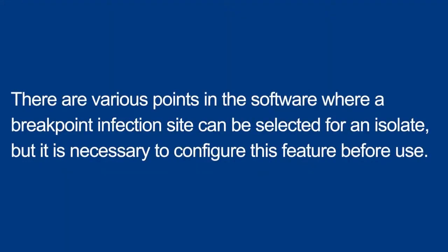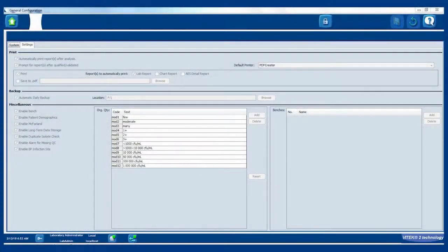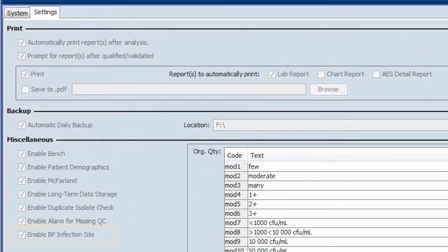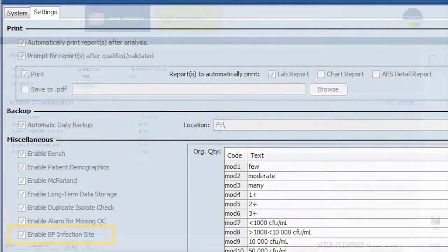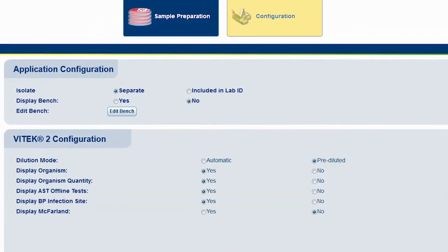There are various points in the software where a breakpoint infection site can be selected for an isolate, but it is necessary to configure this feature before use. This feature must be configured in general configuration of the Vitec2 systems application, as well as on the configuration of the Vitec FlexPrep.